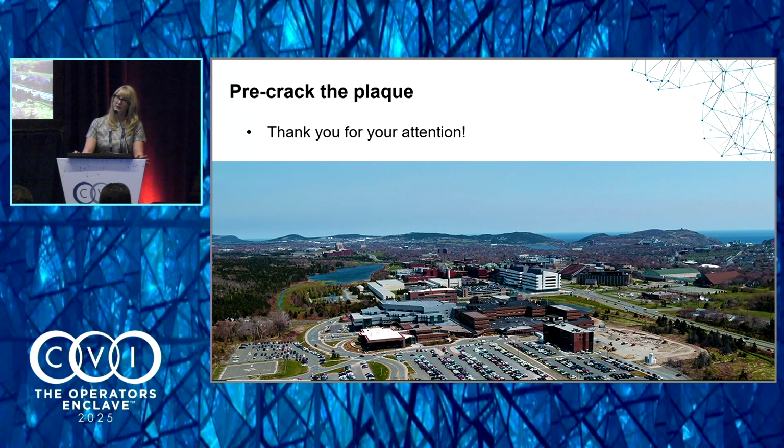It's actually still a big concern. The reason I use one wire is because I have a fair bit of experience with these balloons, and I find that I can get away with it if I choose the right wire. If you're using a Sion Blue, it will absolutely stick to it. I do think it's less of a problem than when you're using the larger size OPN, but it will still happen with those small balloons if you're going up to 40 atmospheres, especially repeatedly, if you use the wrong wire. So when I'm using OPN specifically, I tend to use a lot of Runthrough Extra Floppy, or you can do exactly as you said and just put a buddy wire down. So I would still be cautious of that. Either use a wire that you've had good experience with not sticking to the device, or just throw a buddy wire down.